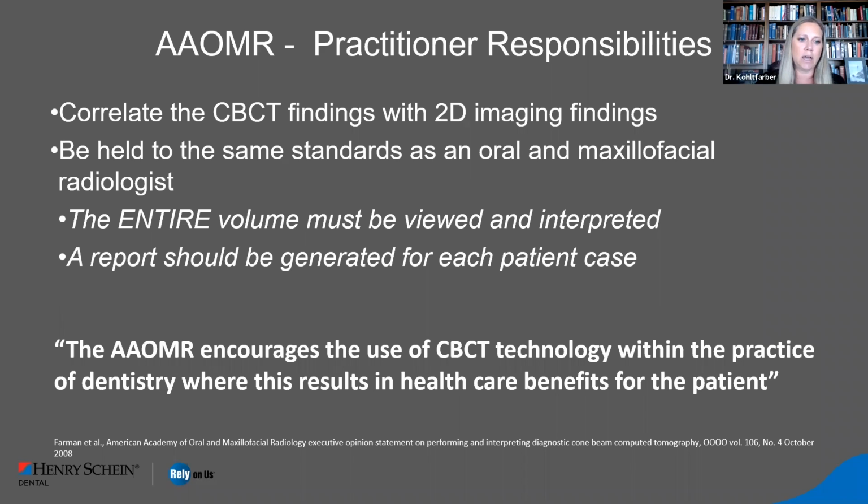Well, this is exactly like any specialty. So if you were to do a root canal treatment, you're held to the same standards as an endodontist. If you extract a tooth, you're held to the same standards as an oral surgeon. So I think it's with anything that you choose to do that's, many times considered definitely within the realm of general dentistry, but we're always held to those higher standards. And so it's the exact same thing here with reading and evaluating your scans, is that you'd be held to the same standards as an oral maxillofacial radiologist.